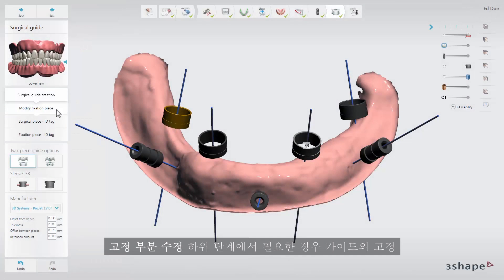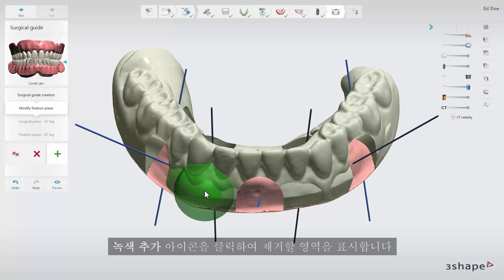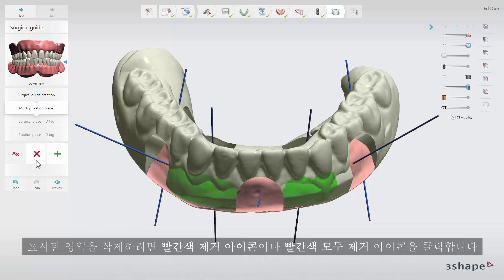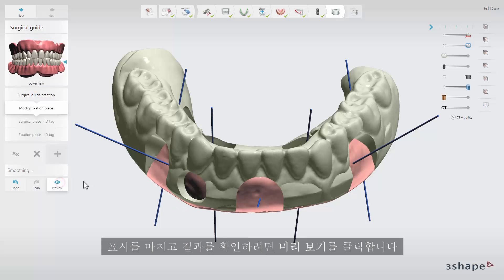At the modify fixation sub-step you can remove excessive material on the fixation piece of the guide if needed. Click the green add icon to mark the area you want to remove. Press and hold shift and scroll the mouse wheel to change the diameter of the sphere to modify the area of removal. To delete the marked area click the red remove icon or the red remove all icon. Click preview to see the result when you are done marking.